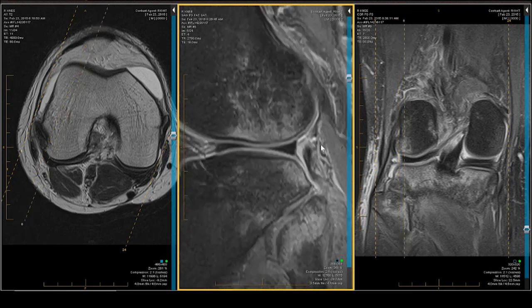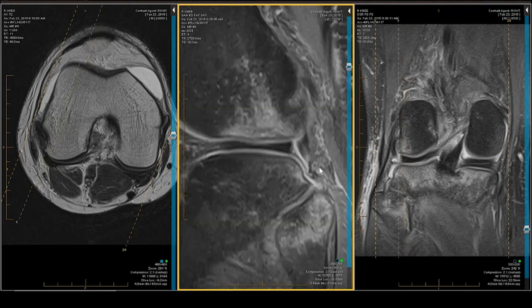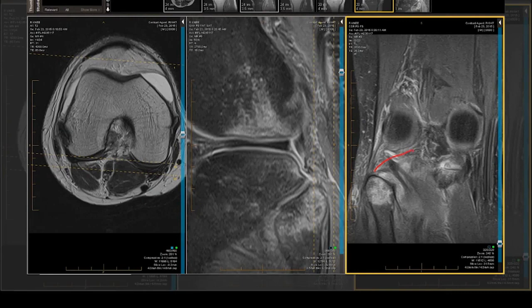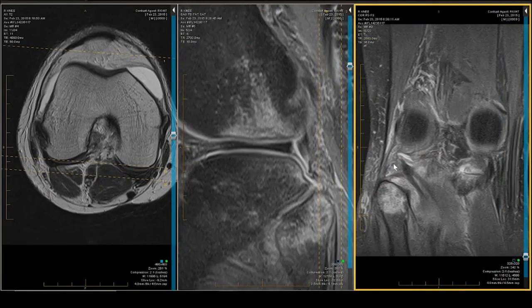Behind the popliteus tendon, the arcuate space is a glorious mess. It looks somewhat linear on one cut, but on the very next peripheral cut it becomes a bag of blood and a torn, coiled arcuate complex. In the coronal projection, the lateral limb of the arcuate is blunted, and the oblique limb's course is filled in with blood — confirming an arcuate tear alongside the popliteofibular ligament tear.